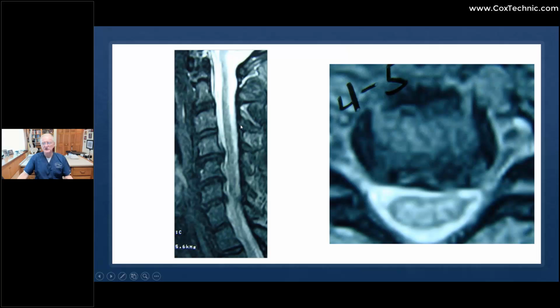In using manual distraction or automated distraction, we always contact the triple joint complex above, in this case, C4-5. But in doing that, we will be reducing 5-6 and 6-7, because we're above, we're applying a distraction force. If we were to contact, say, down here at C7, now we could be driving nerve root into the level here and here. So always contact above the disc level of herniation, as long as you're doing it manually.